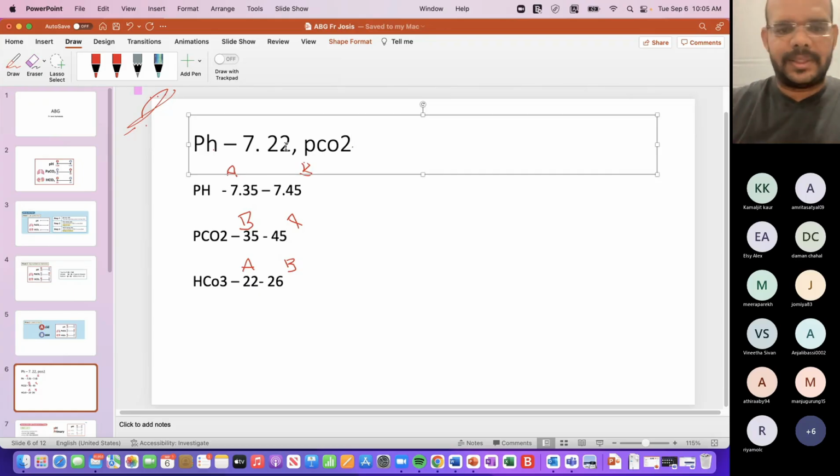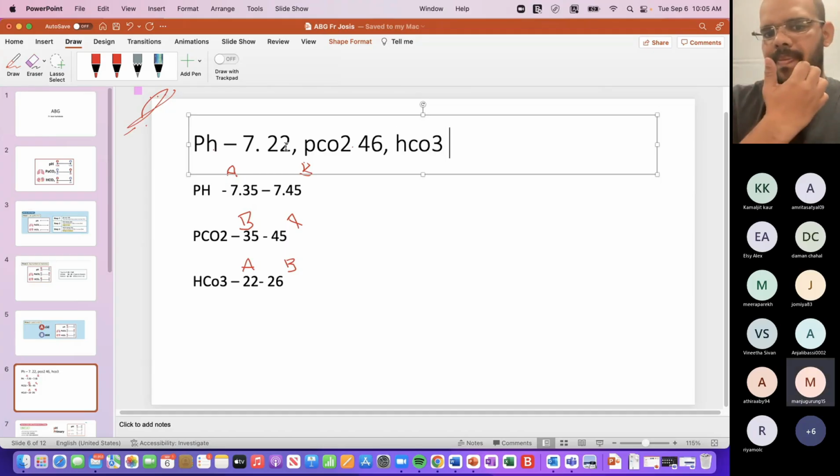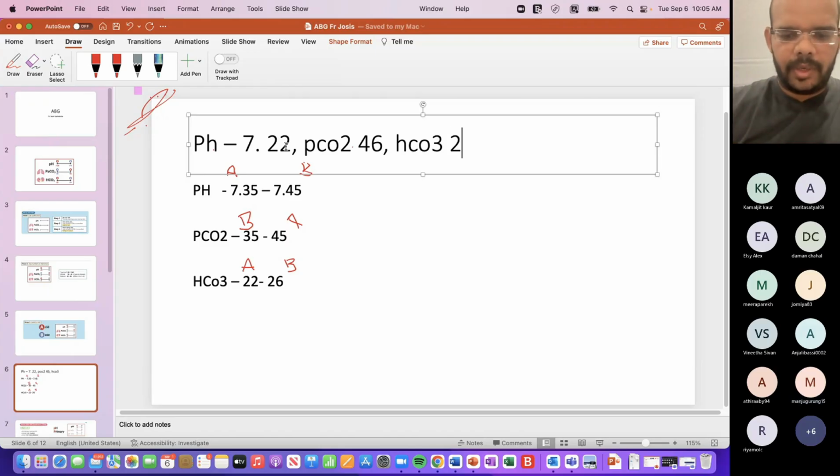PCO2 is 46. Bicarb is 29. So that is your value, that is your question. pH is 7.22, PCO2 is 46, bicarb is 29.